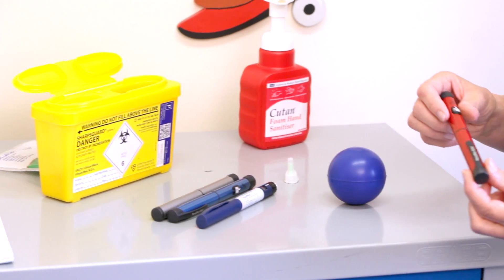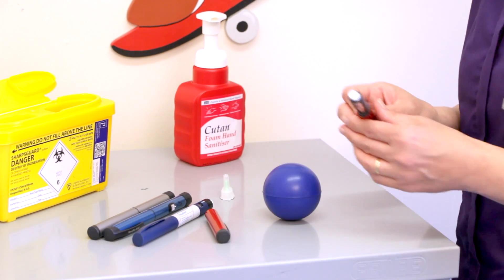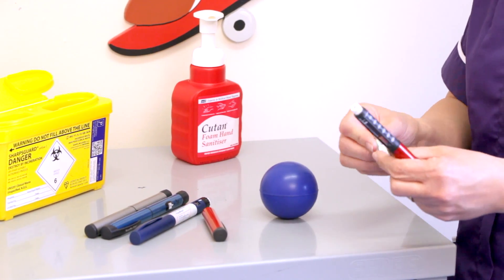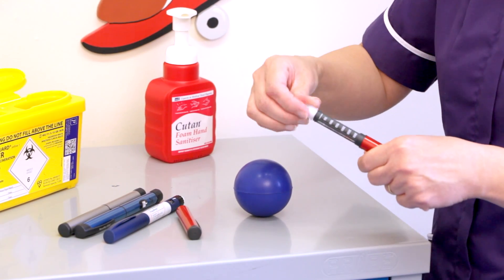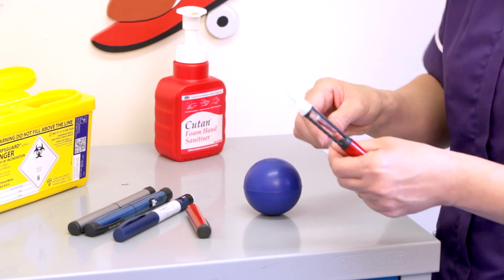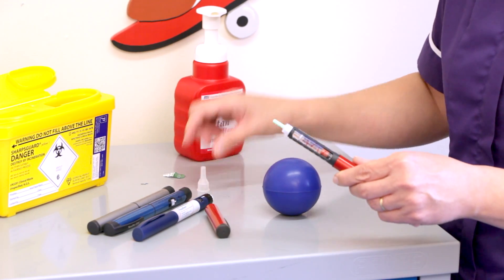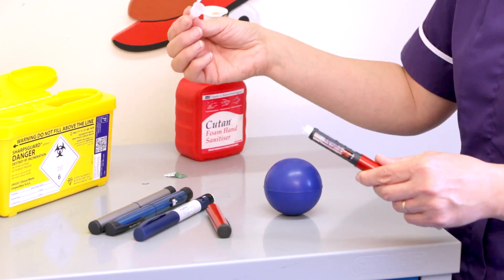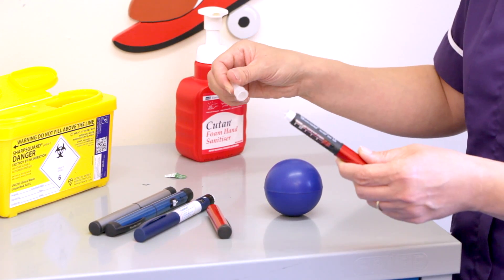The first thing you need to do is remove the cap and then put a new needle on. It's important to use a new needle every time. Peel the top off and then screw the needle onto the pen top. Then remove the two covers, and it's important that you keep this cover in order to take your needle back off.